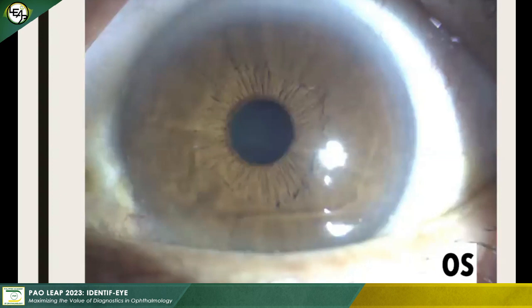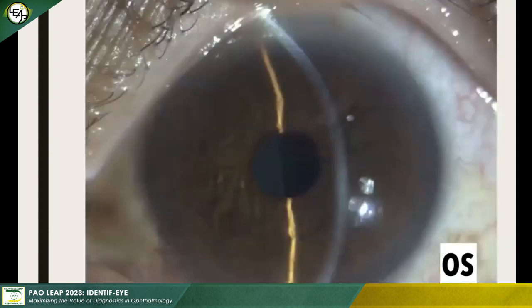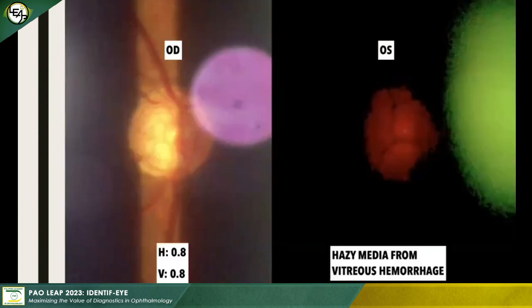The left eye also appears normal at first glance, but on higher magnification, we see fine rubeosis already present in the pupillary border. So notice that there are light red flecks in the superior sector, even temporally and nasally. So again, the chamber is also deep. So you would think that it's probably an open angle.